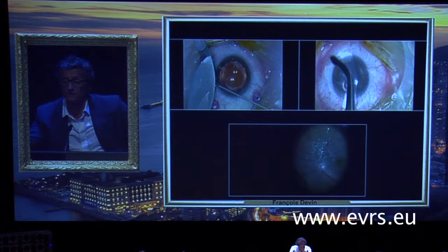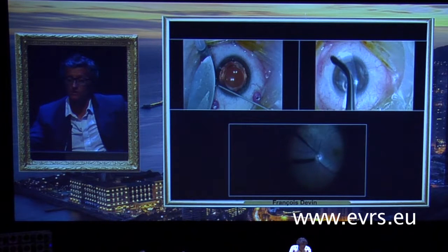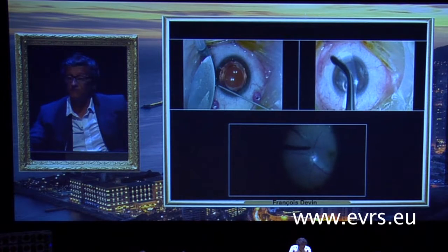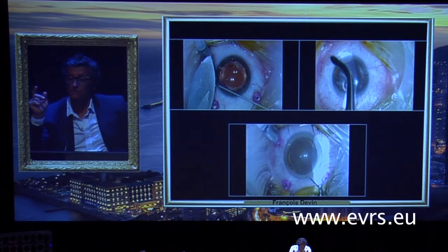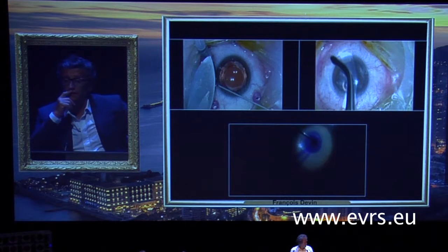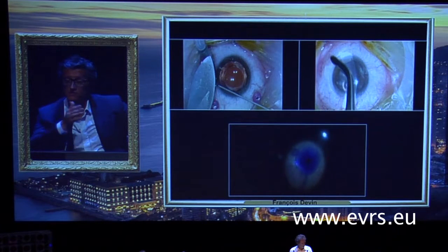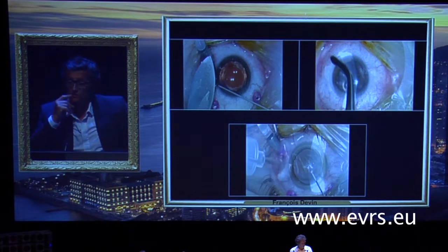Yes, it's just to show you that with aspiration you can detach the posterior hyaloid. In this case, it's not triamcinolone but amyloidosis. And it's very convenient to detach the posterior hyaloid with the 27 gauge. If you want to peel the ILM, in this case of amyloidosis, you also have an epiretinal membrane, and after the detachment of the hyaloid, if I want to remove the ILM, I show you that you can just break it a little bit at the beginning, and so you have to try to grasp in double, but you can do what you want, except in myopic eyes.